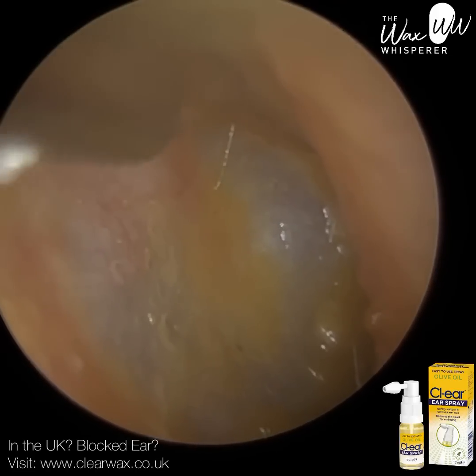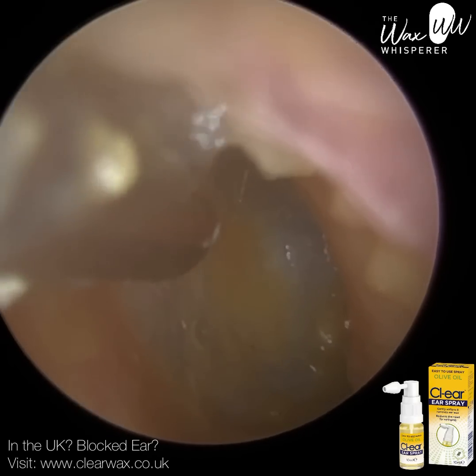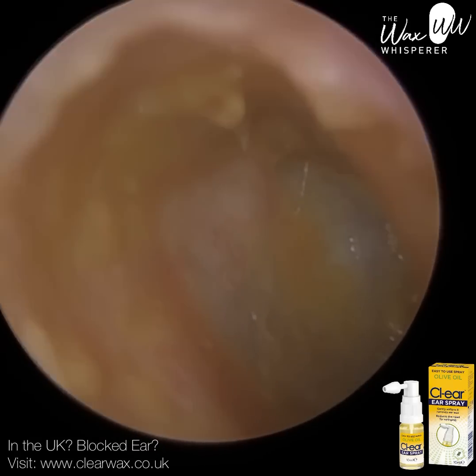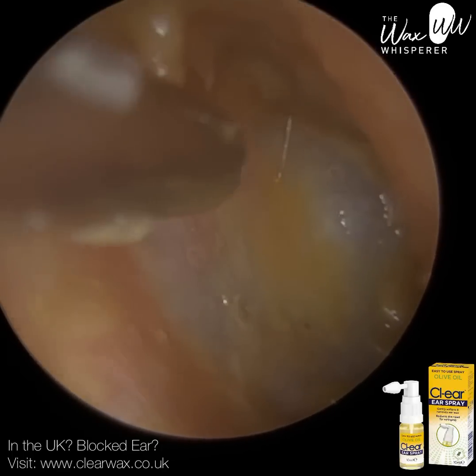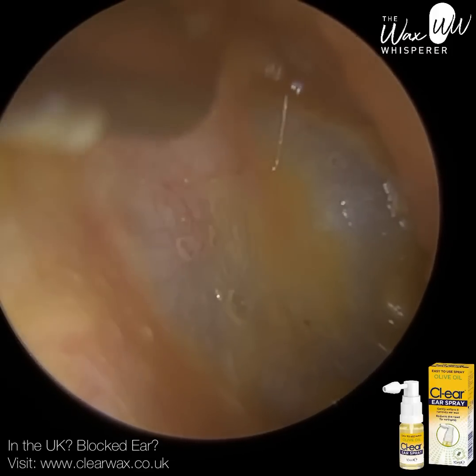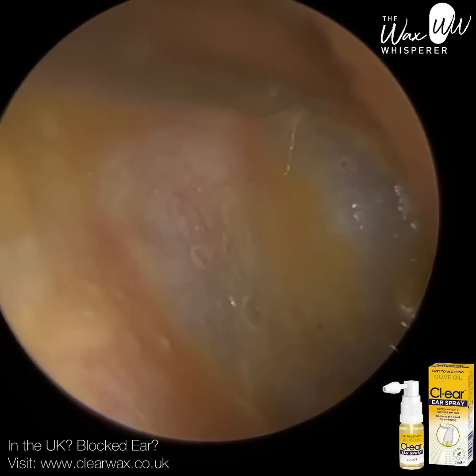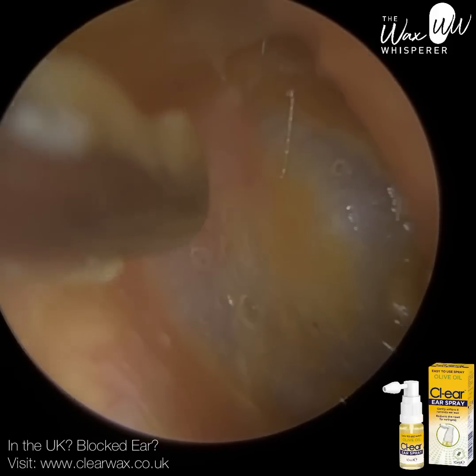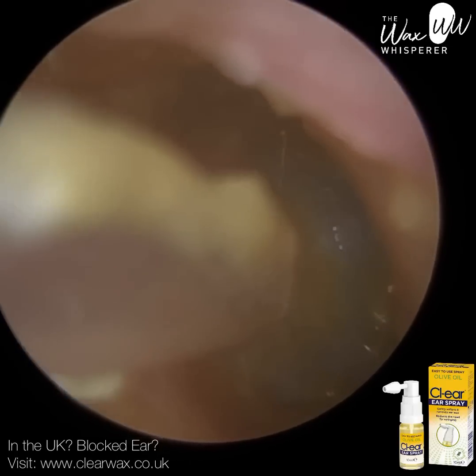We're just in what we call the anterior superior quadrant — the northeast region. Just a bit of skin that was obscuring the view, so I'm just peeling this out of the way. Even at this stage, the patient can hear significantly better. I just want to see if I can get as much out as possible without risking any trauma to the patient. Sometimes with ear care, less is more — it's something I always explain when training our Clear Wax delegates. The more confident and experienced you get, the more wax you can go for. But it's very important when you begin ear care that you know your limitations.